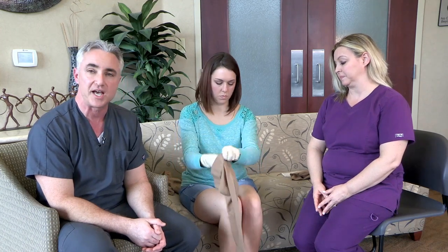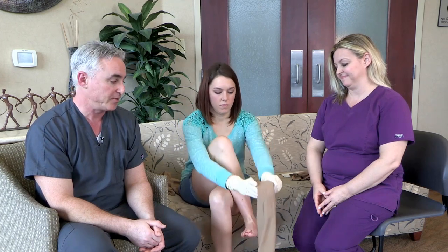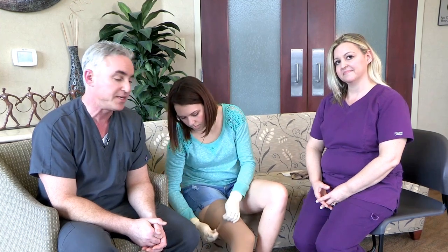To put the stocking on without a device, first reach inside and grab the heel of the stocking with your hand. Then pinch the heel and pull the stocking back up to the heel — you don't want to go beyond the heel. Turn the stocking over, put your foot inside with the heel down. The hardest part is getting the foot and ankle in first, but once you do that it's much easier to just pull it up to your thigh. It's really important to check that there are no wrinkles in the stocking, especially behind the knee. If you leave a wrinkle, as you walk and move it can pinch the skin and often leave an open sore, so be very careful.